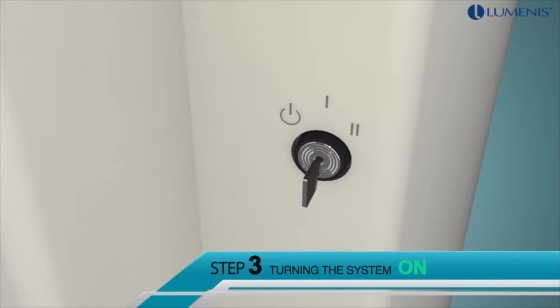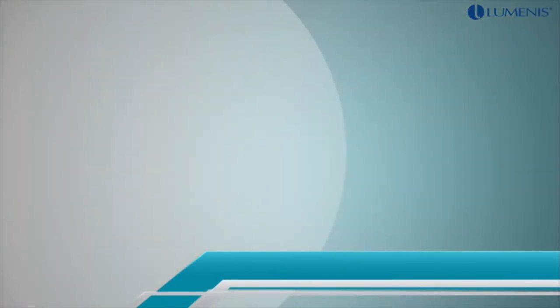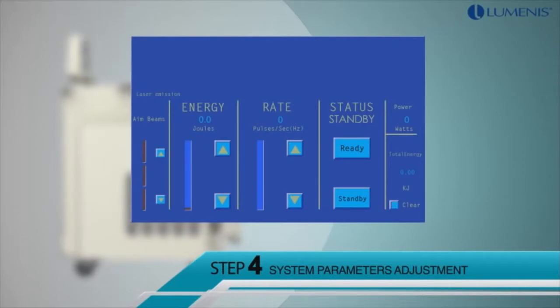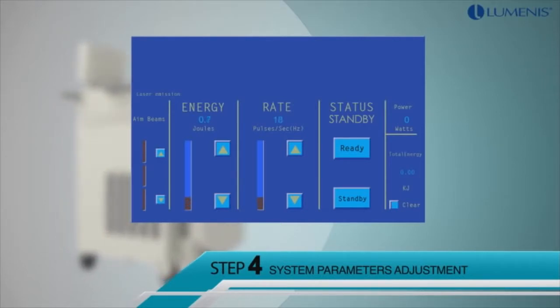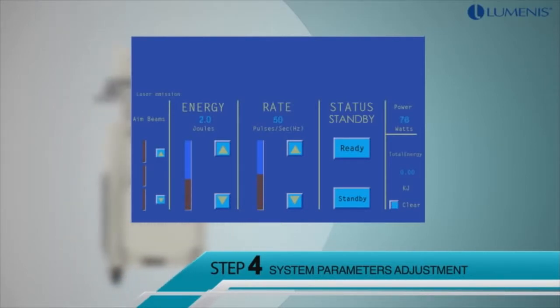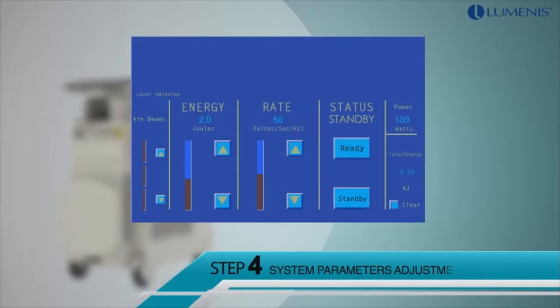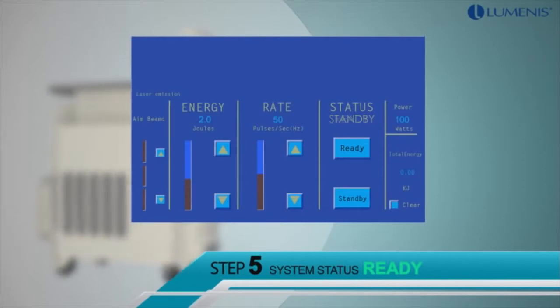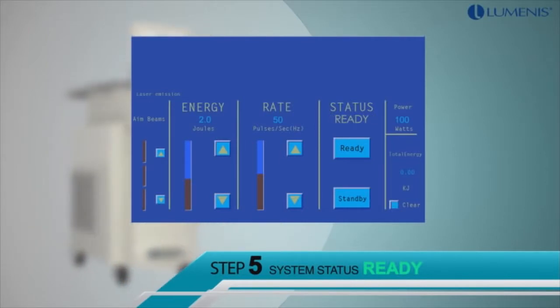Step 3: turning the system on using the key switch. Step 4: system parameters are easily adjusted using the touchscreen. For HoLEP, the recommended settings are 2 Joules and 50 Hz for a total power of 100 watts. Step 5: switch the status of the system to ready and press the foot switch to start lasing.